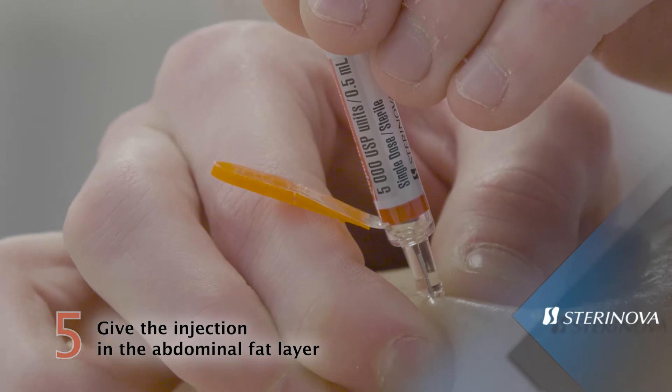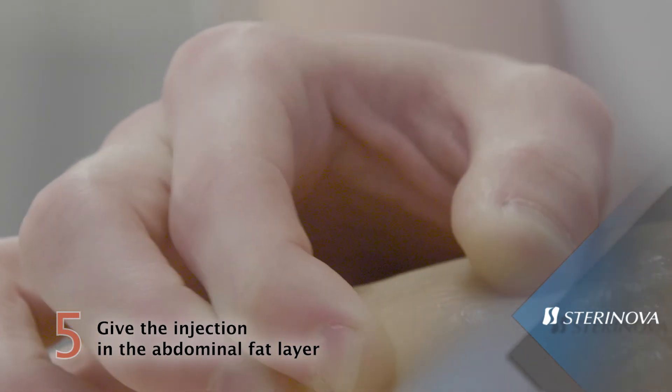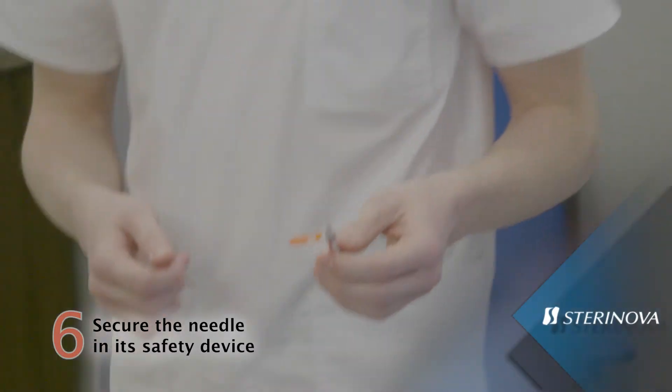Do not rub the injection site after administration of the product. Remove the needle slowly and press the injection site with a piece of gauze for a few seconds.